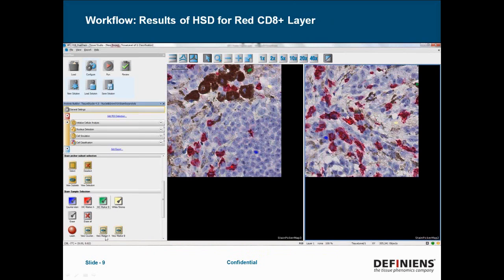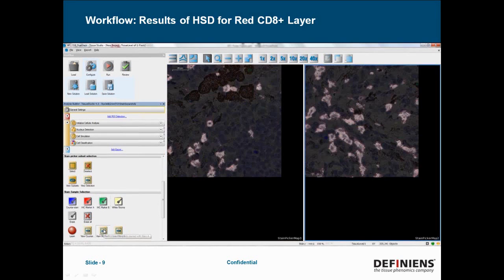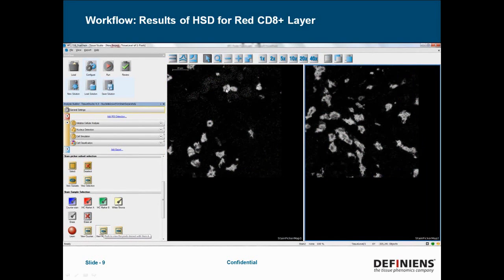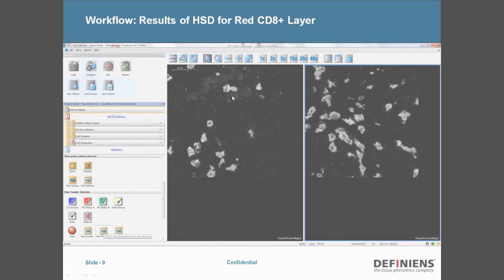One nice feature is that we can then check the results of the stain isolation. If I push this button down here — view marker A — I can see the results of extracting out the red CD8 positive channel.